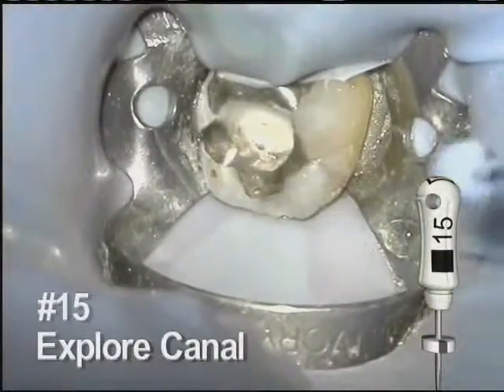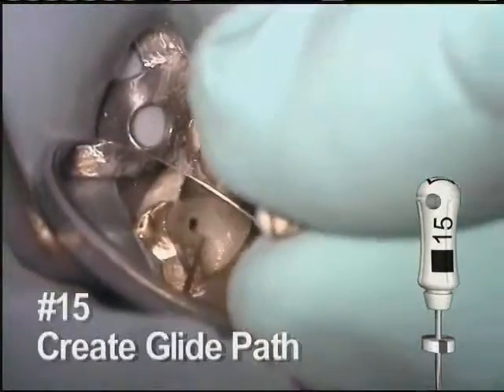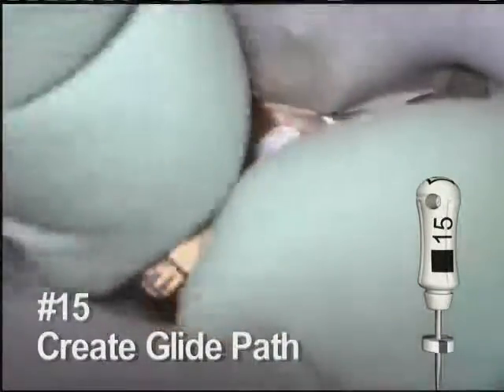Based on the anatomy, the next hand file is pre-curved. This number 15 file is worked gently to create a glide path for the rotary instruments. It goes to about the same depth.